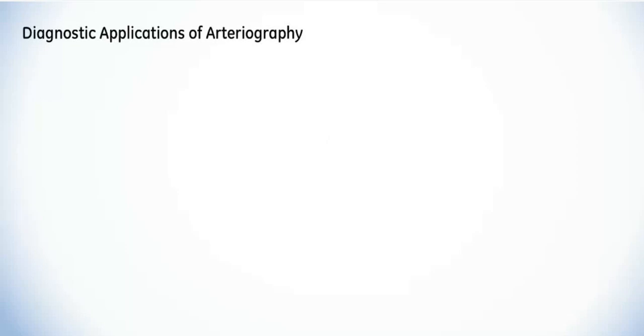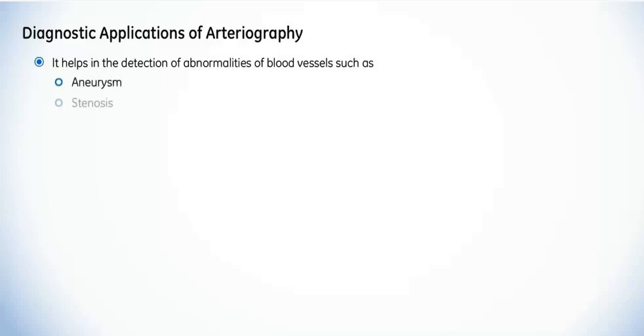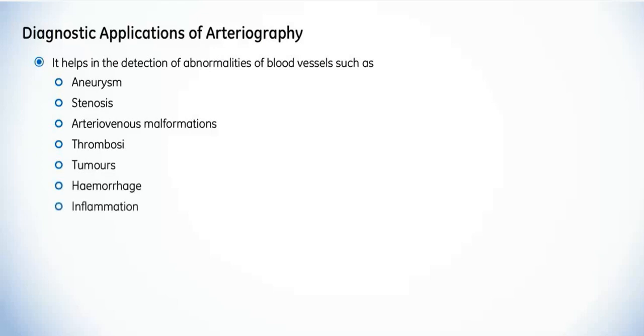Some of the common applications of arteriography are detection of abnormalities in blood vessels, such as aneurysm, stenosis, arteriovenous malformations, thrombosis, tumors, hemorrhage, inflammation, and assessment of invasion of tumors into blood vessels.